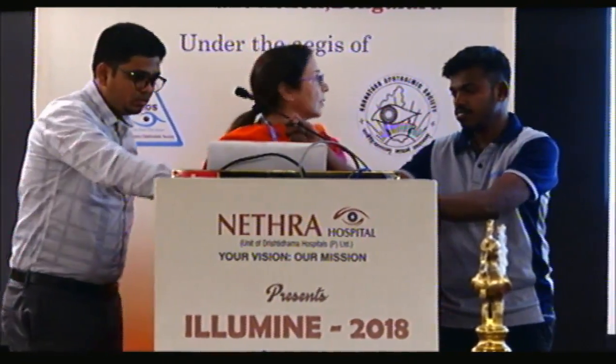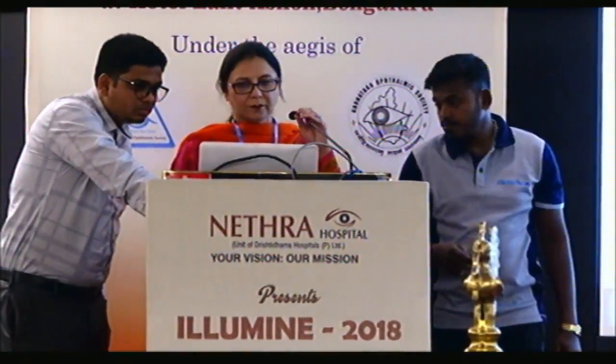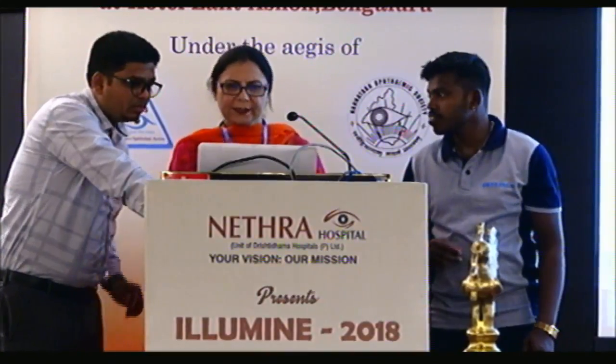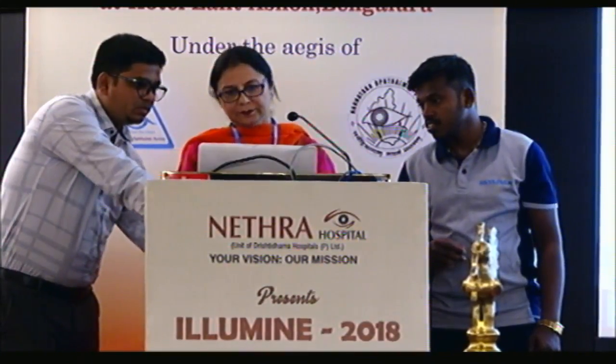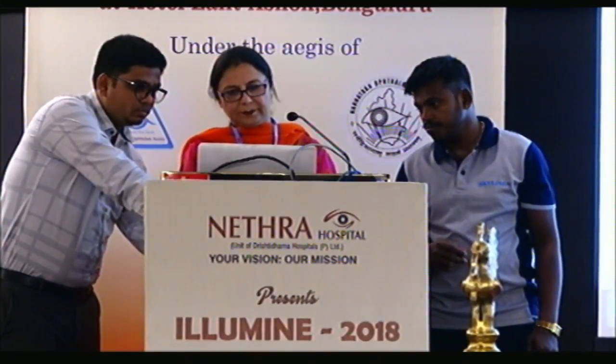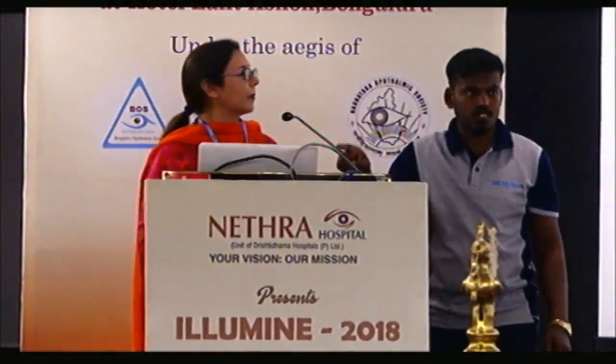Another marker for us to note in case of chronic CSR. So in conclusion, what I'd like to say is, because we have multimodal imaging and so many various technologies to see, the best thing is to put all these images together: FFA, ICG, OCT, autofluorescence, and everything together. Only then will it make sense to analyze the patient and decide on patient management.